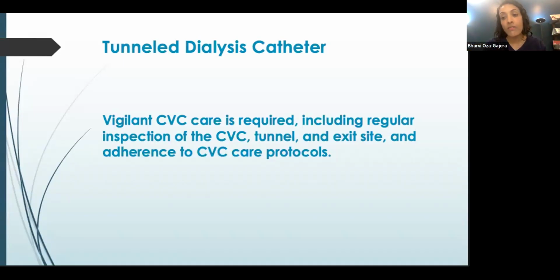So be cognizant of the fact that there are sutures there, and look up when they were put in and when they need to come out, and be aware of that. Check for any drainage or redness, erythema, tenderness, anything along that exit site and the tunnel leading up to the venotomy that seems like it might be something worth looking into further.